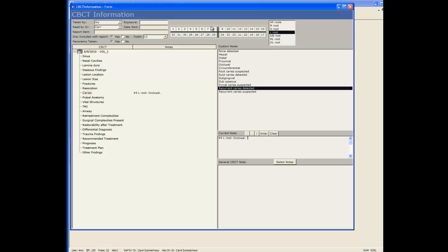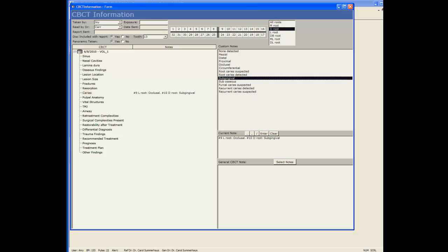Now I want to do tooth 10, distal root, subgingival and as I'm clicking items it's typing it here under current note and also showing it over here next to carries.